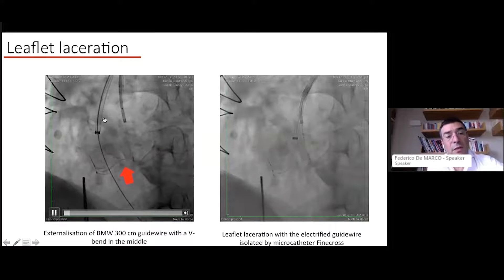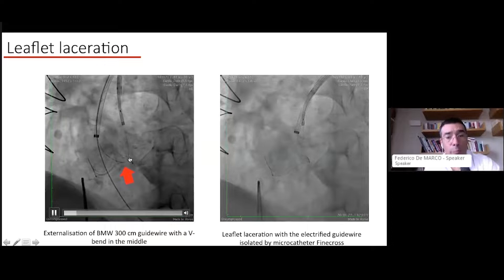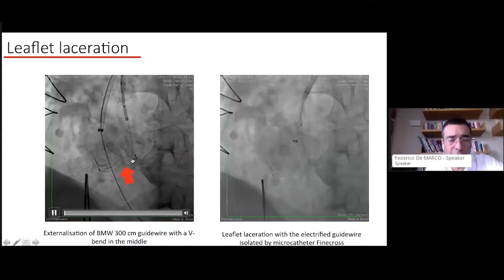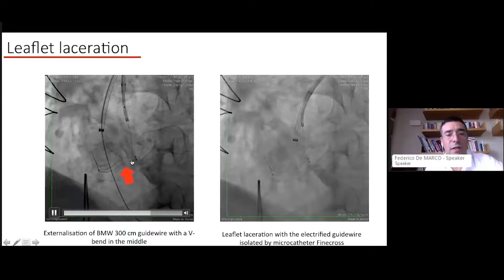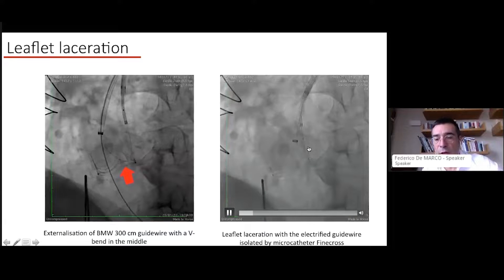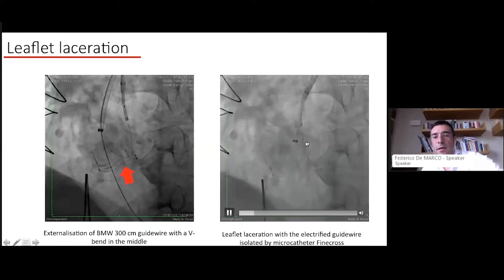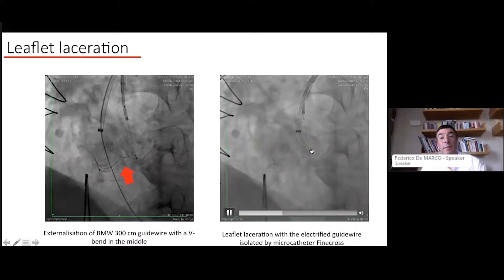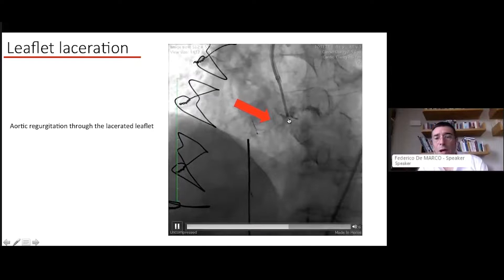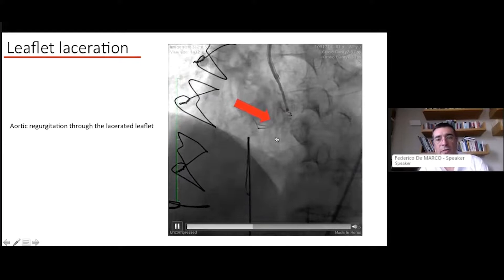Once your V-shape — formed by bending your 300cm wire with the cover scraped off — reaches the bottom of the leaflet, you are ready to deliver electric energy and perform the laceration. You generate energy at that point and two operators simultaneously pull both systems to lacerate the leaflet. The pulling force and energy required are both quite high. After transecting the leaflet, you can check with angiography.